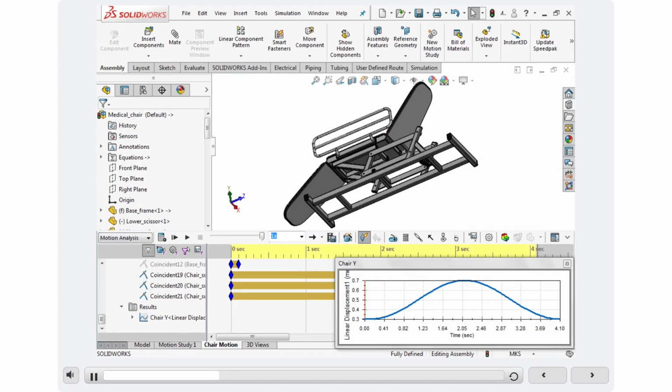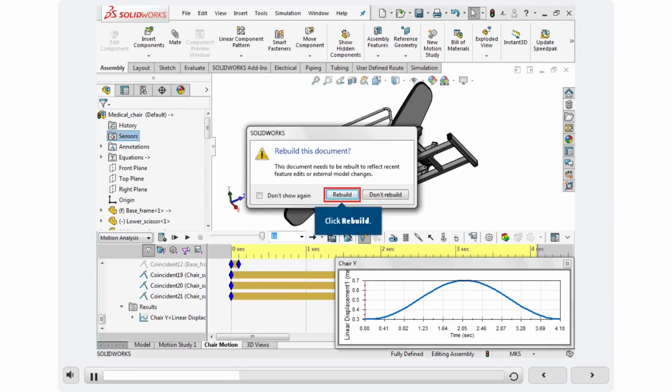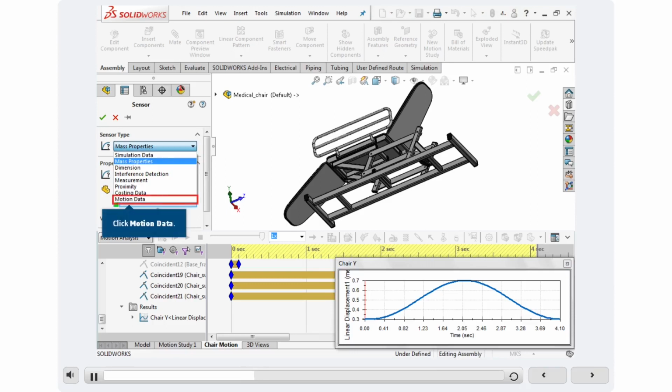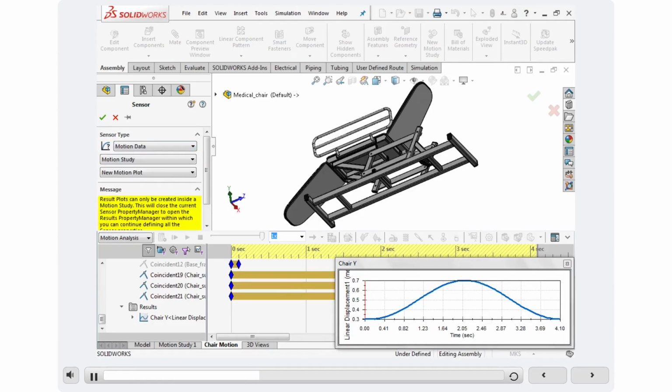Now, we will create a sensor for maximum displacement. Right-click the Sensors folder. Click Add Sensor. Click Rebuild. For sensor type, click the drop-down arrow and click Motion Data. For Motion Study, click the drop-down arrow and click Chair Motion. Under Motion Study result, click the drop-down arrow and click Chair Y.